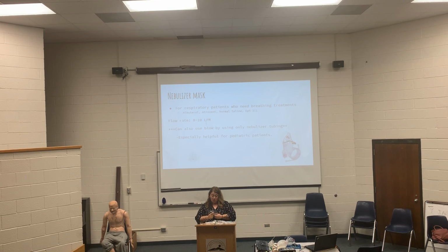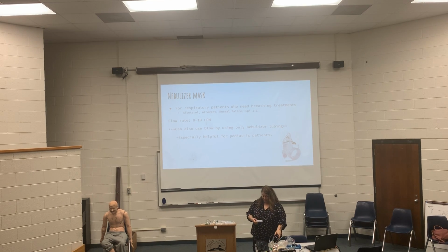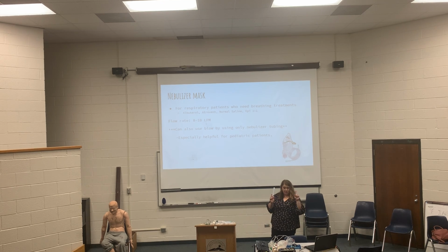But if they cannot tolerate that, then you will put together, I'll put this together just out of habit. So it comes with these 3 pieces. For the first few times, if you don't put them together right, don't feel bad because you saw me even struggle sometimes to put it together right. But so you take this T-piece, see, and there's a smaller end on this T-piece, and we'll pass it around, let everybody see it. And you hook that together, and then you put the mouthpiece on.